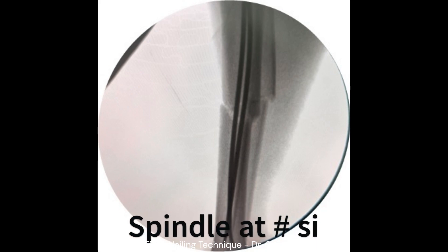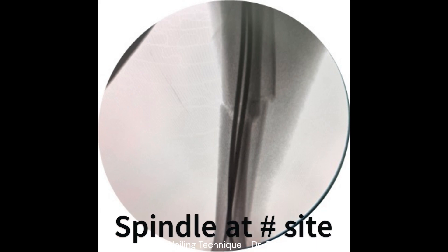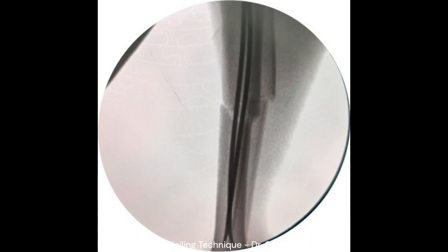Both nails are then advanced to the distal metaphysis level. Once entered to the appropriate length, a spindle is formed at the fracture site to keep it reduced and stable until healing.